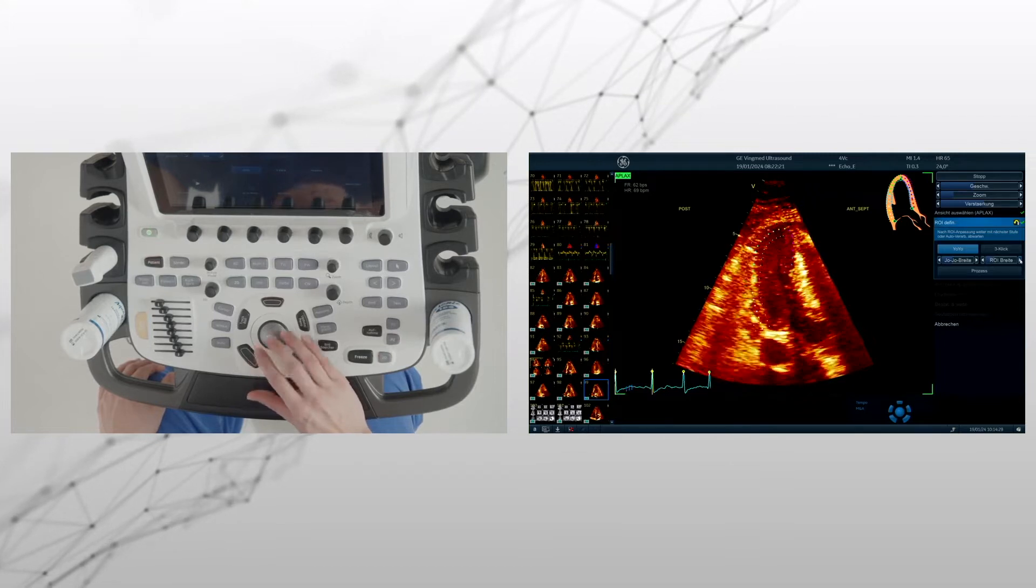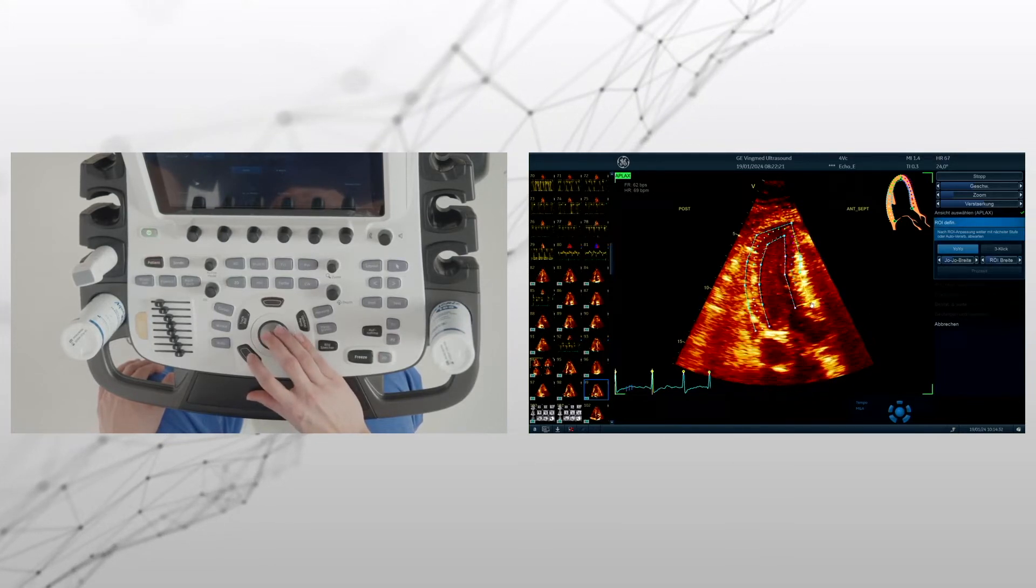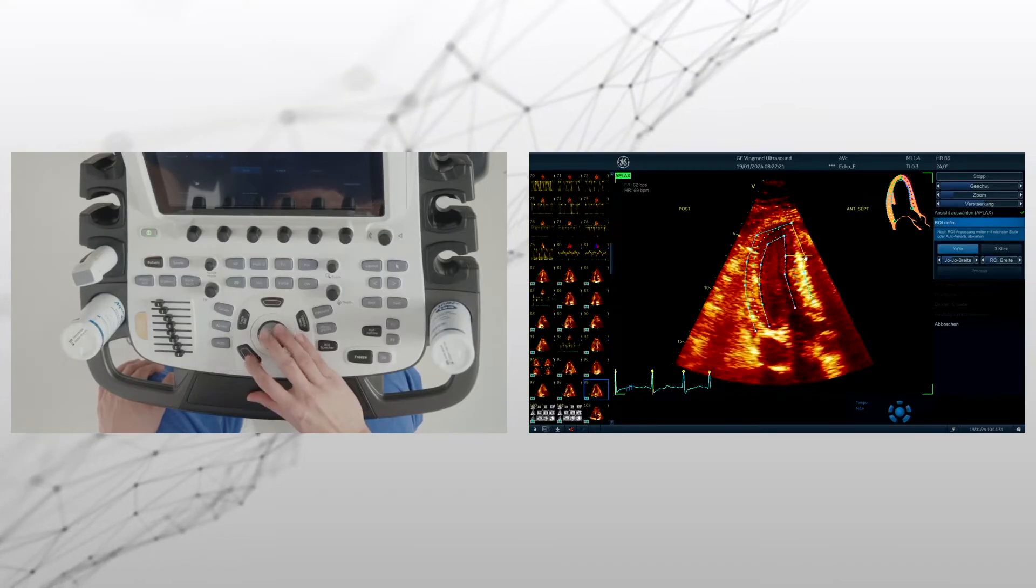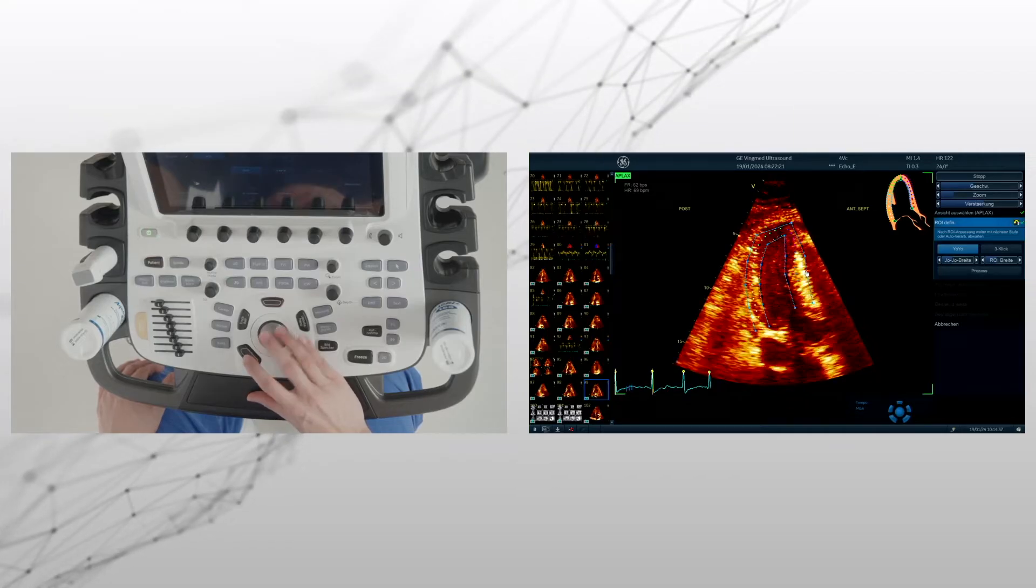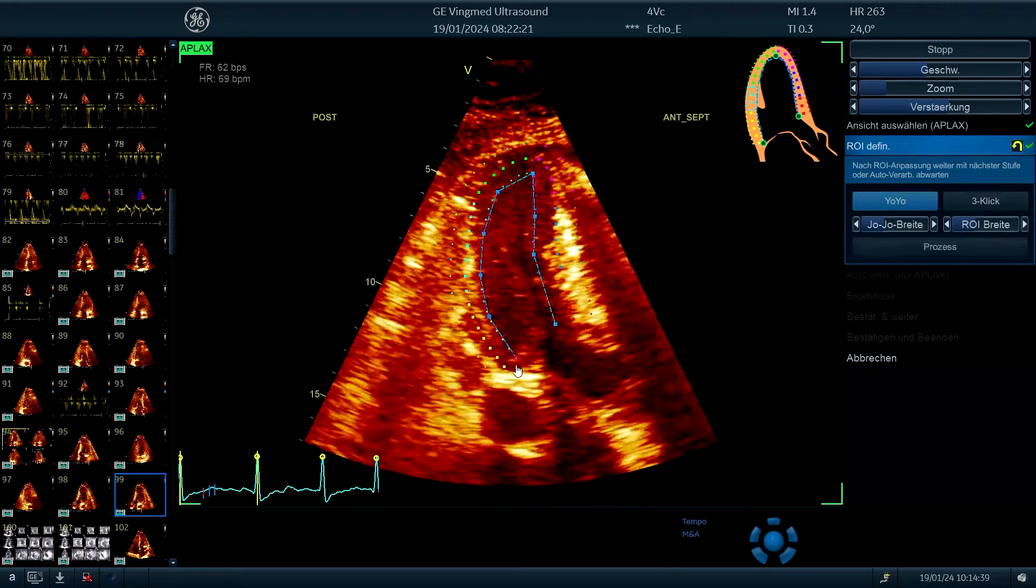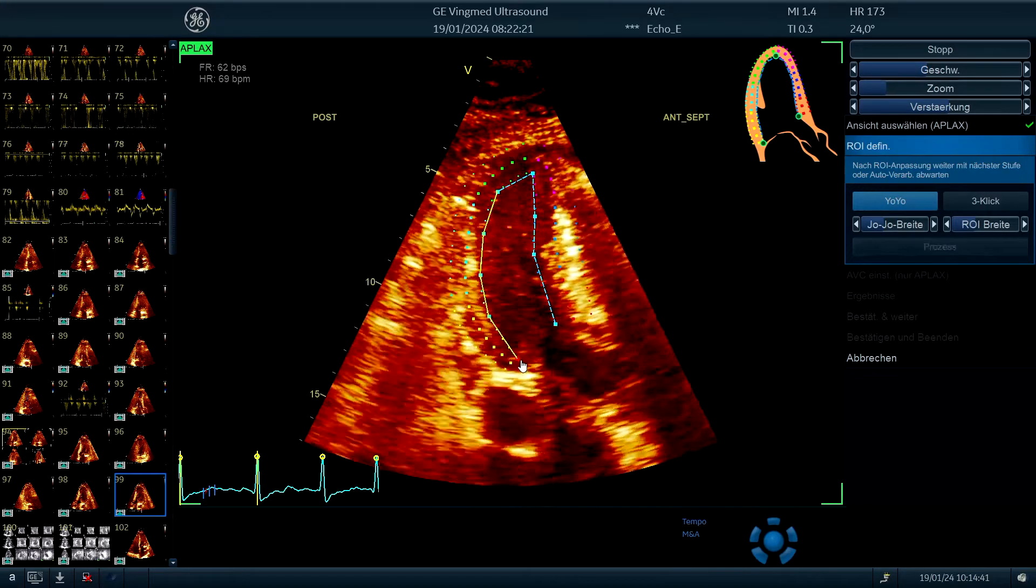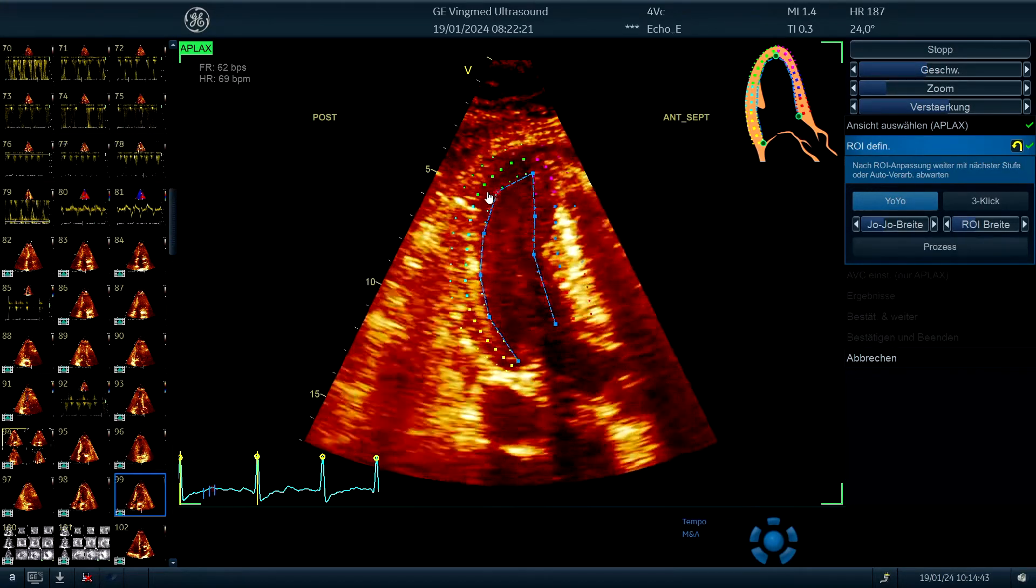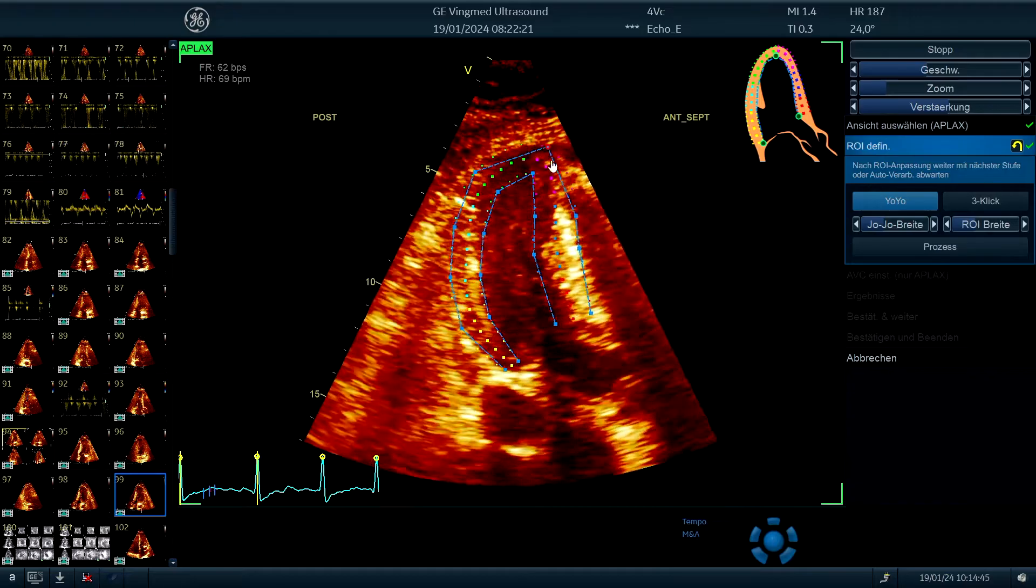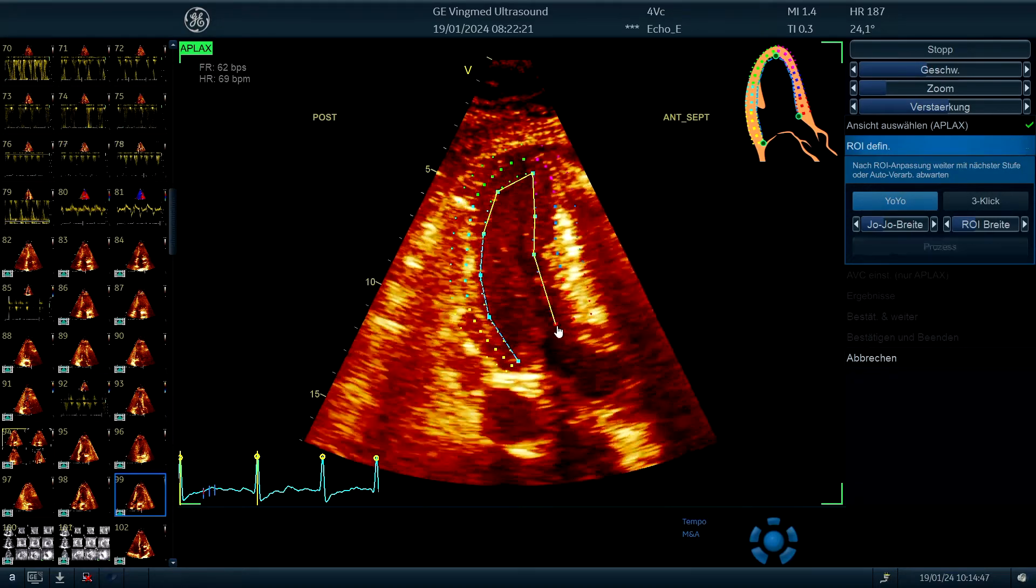So we have to have a larger region of interest, a larger ROI, and we also have to adjust the measurement on our own a little bit. So this is not generally recommended, but if you have hypertrophic cardiomyopathy as in this case and you see that there's really a hypertrophied ventricle, you should adapt.